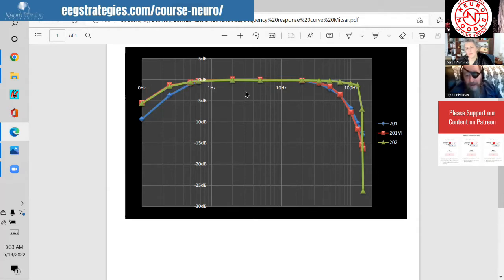But the silver chloride electrodes are able to be used, and then you can actually look at the low frequencies without the measurement itself negatively influencing the measurement. If you have a regular electrode, DC current can flow along the wire. And if you have silver chloride, you're sensing the field outside of the wire, but it doesn't allow current to flow into the wire in the same way.